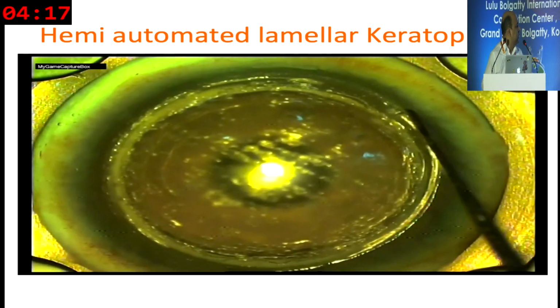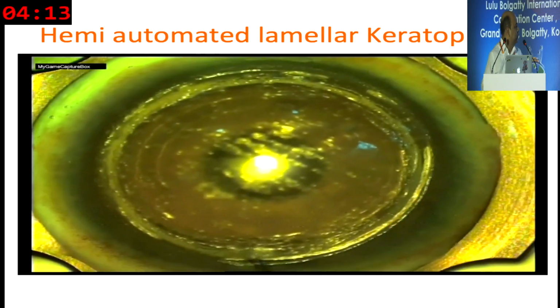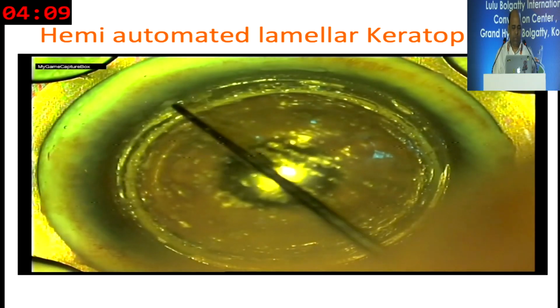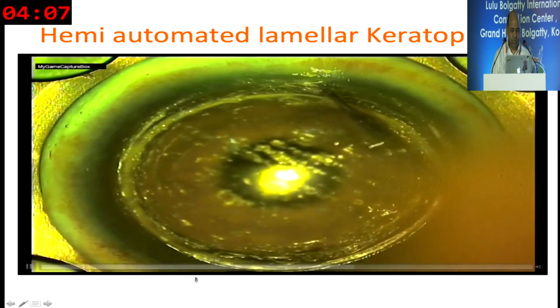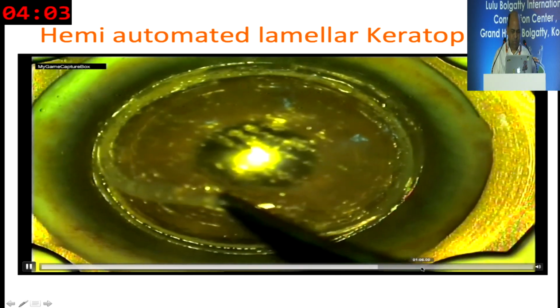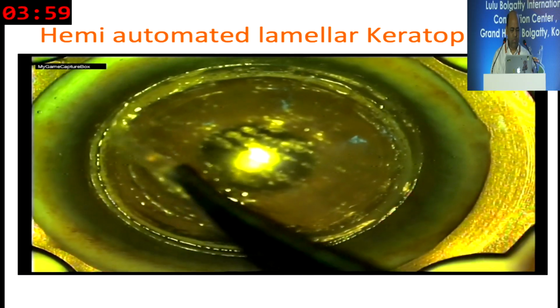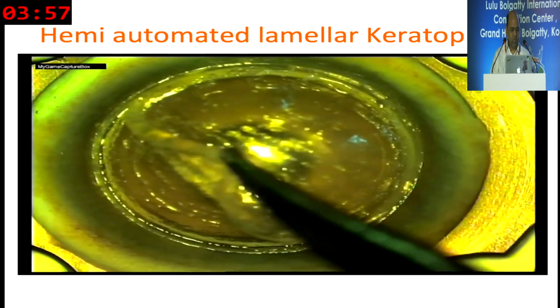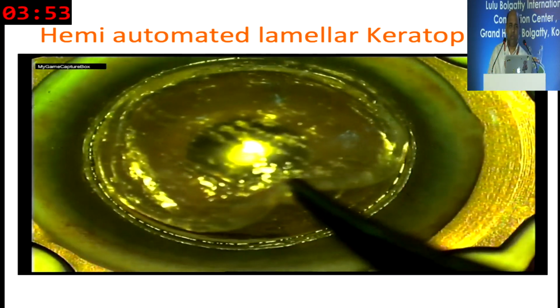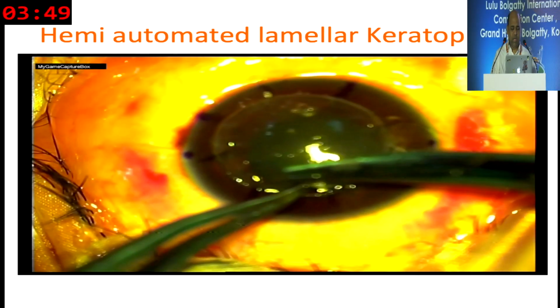And this is a donor. While lifting, we have to be very careful. Sometimes tissue bridges are there, so we need to manually separate those. And once it is done, then the suturing.